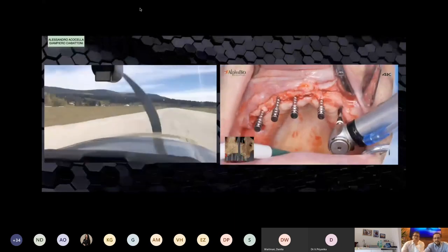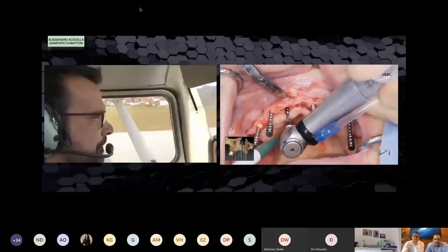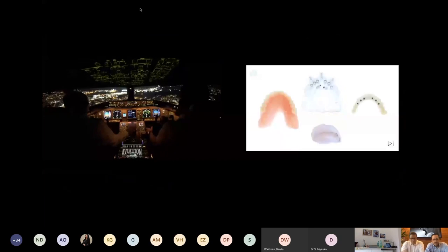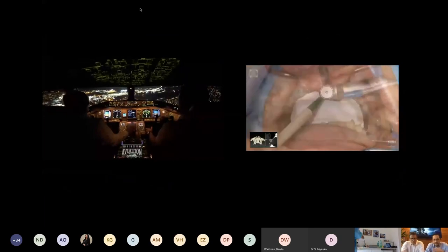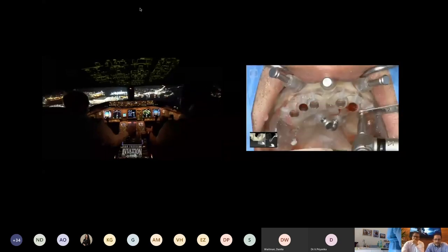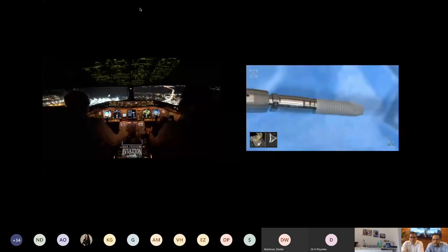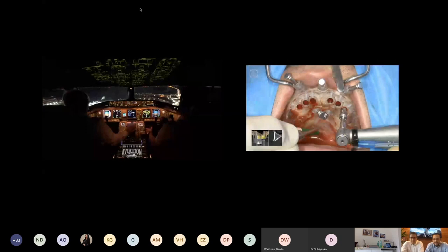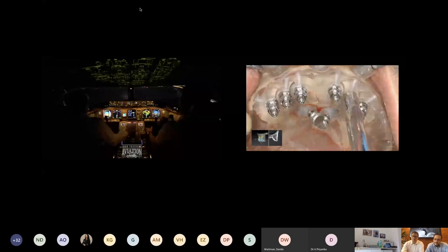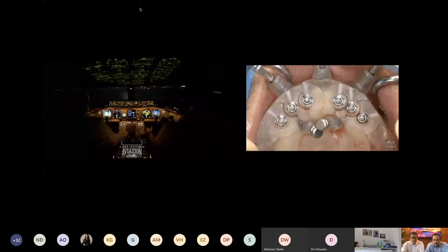But guided surgery is another word. It's like driving a big airplane. You can imagine landing this big airplane in cloudy or rainy conditions, without direct visualization of the landing strips. In this kind of situation, the pilot strictly needs a technology to help him have good control of the situation, like the surgeons, as you see on your right. We have the guide, and we do not have to choose or change the position of the implant. All the positions are planned before.